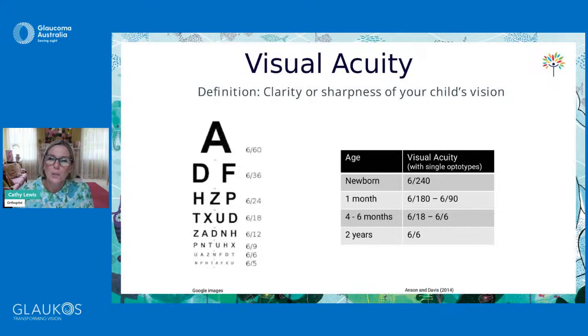And a lot of visual acuity testing on children is performed at 3 meters as we get better concentration and cooperation with the vision chart placed slightly closer. So therefore, the number on the top of the fraction for children is often a number 3, and therefore fully developed vision would be the 3/3. Sitting at 3 meters from the chart, they can read down to the line you should be able to see from 3 meters.